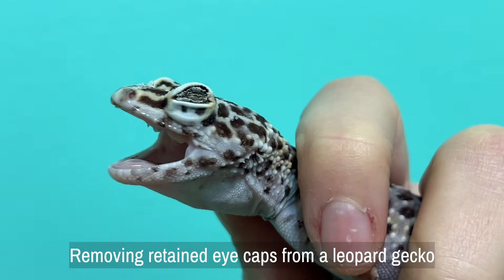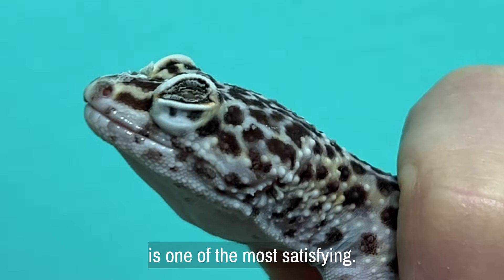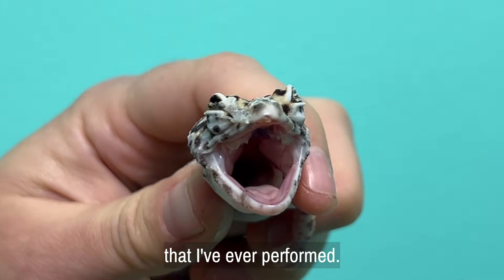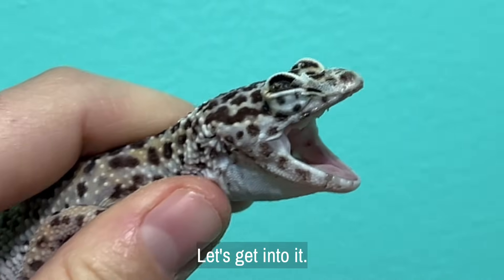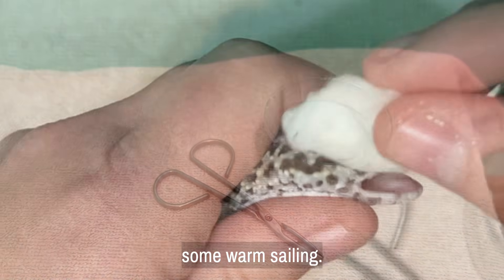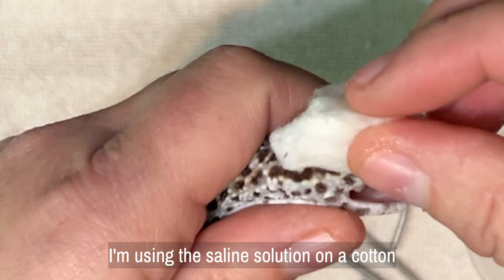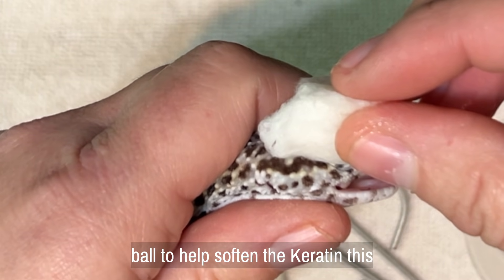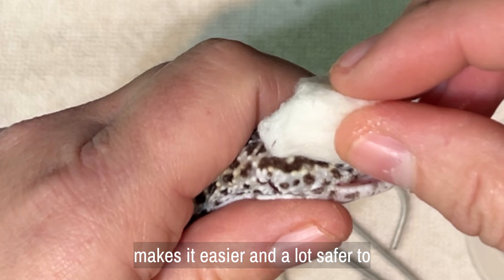Removing retained eye caps from a leopard gecko is one of the most satisfying and immediately life-changing actions I've ever performed. All I need is a pair of clean forceps and some warm saline. I'm using the saline solution on a cotton ball to help soften the keratin. This makes it easier and a lot safer to remove.